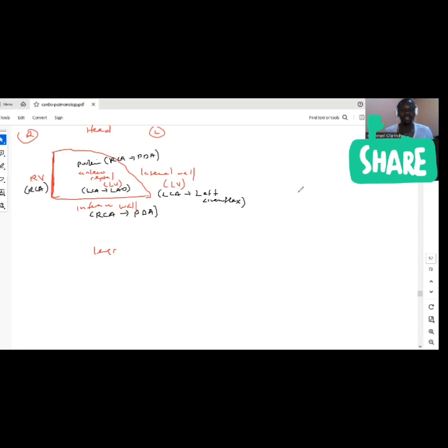Okay, so we know the surfaces of the heart, we know the arterial supply, which ECG leads correspond to that. Remember, the goal of doing an ECG is to figure out the conduction in the heart. Is the electric connection working well? Things like that. And we can also find out some other things, like are the muscles bigger, are they impacted, things like that. So we have, based on how we place the leads.